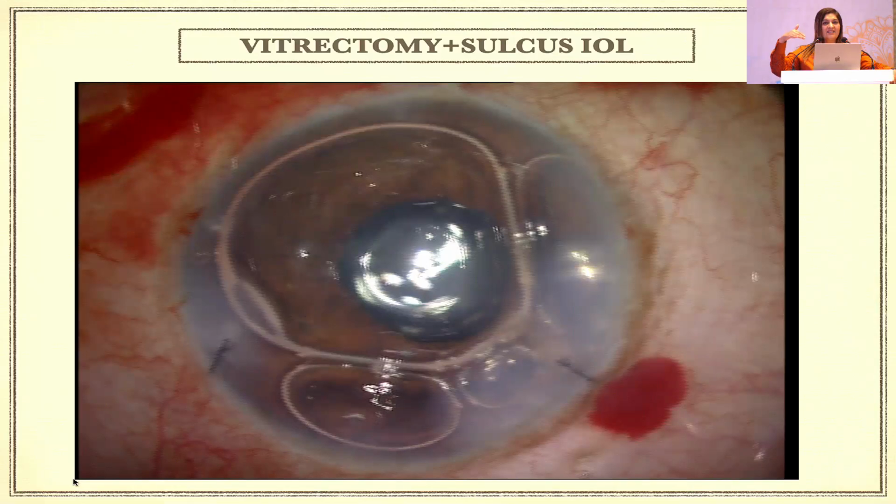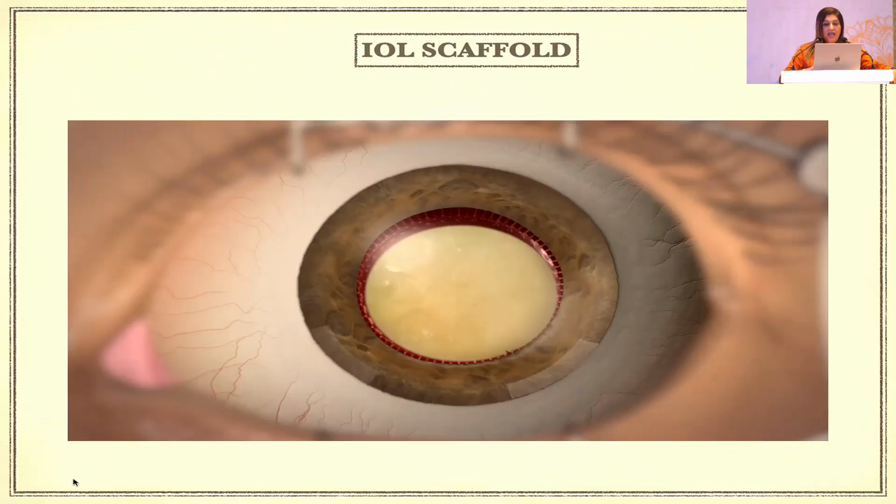that if your iris is flabby, or there's a chafing of the iris, it might go around the edges of the optic of the IOL, and then it might stick with the posterior. Anyway, there's no posterior capsule out here, but with any of the rhexis margin or things like that. So you do not want any entrapment of the iris tissue coming up in these cases.